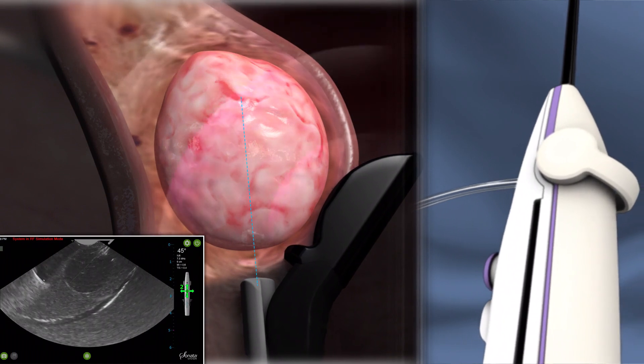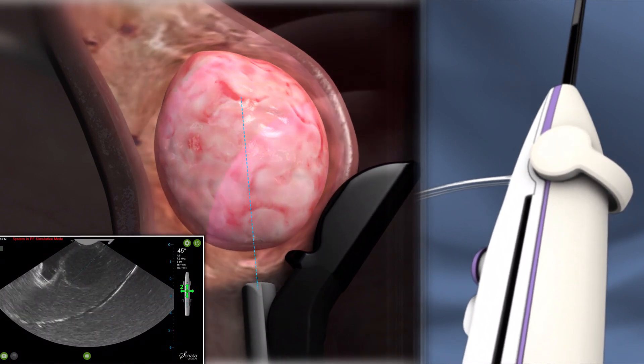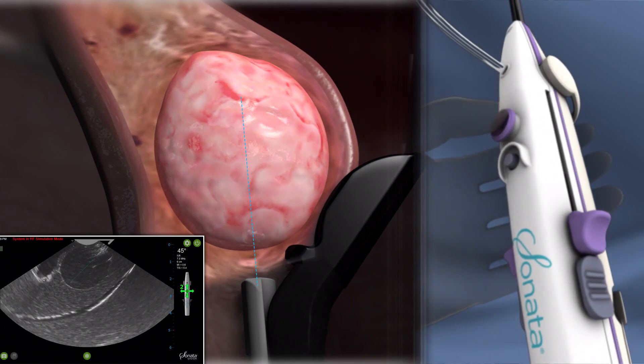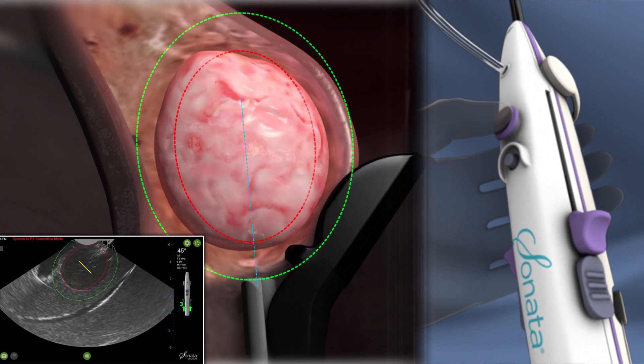Graphics are displayed on the ultrasound image to guide the operator. No manual measurements are required. The red ellipse represents the ablation zone and the green ellipse represents the thermal safety border. The thermal safety border must stay within the serosa at all times during the procedure.